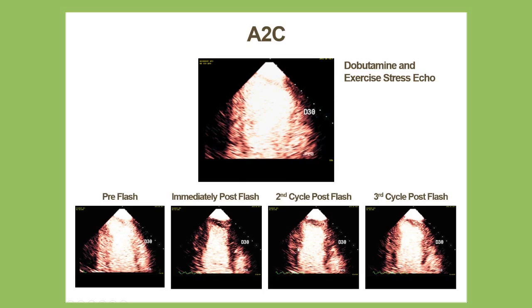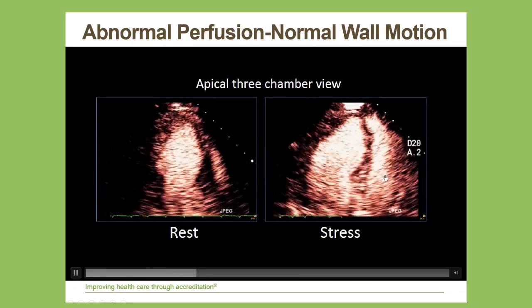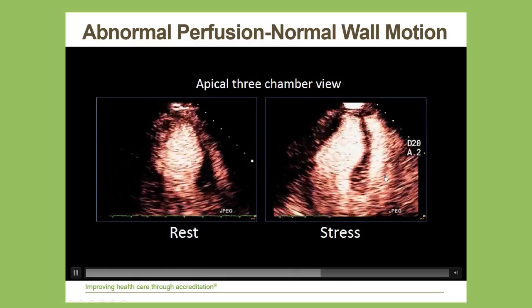Under resting conditions with normal capillary blood flow, the contrast enhancement occurs within 4 seconds, but during stress imaging, it should occur within 2 seconds. So we typically look at the regional wall motion and then also look at the replenishment of contrast as a function of time to see if there are perfusion defects that sometimes occur in the absence of a wall thickening abnormality.